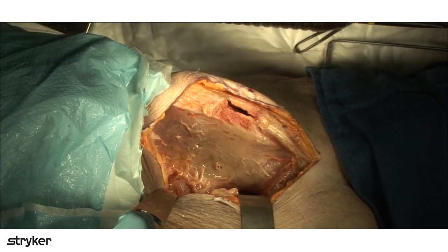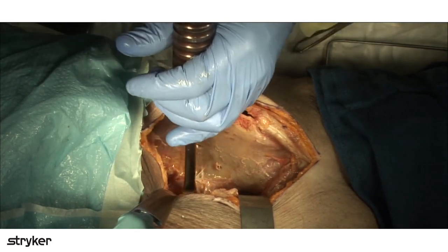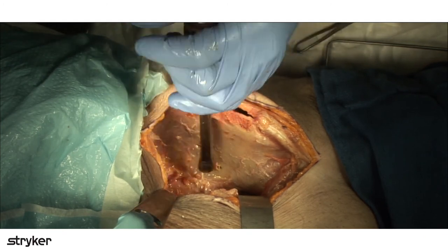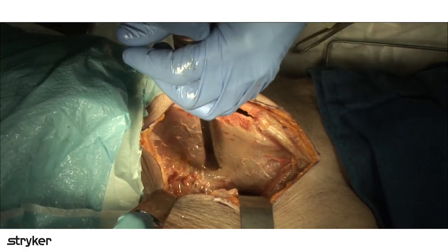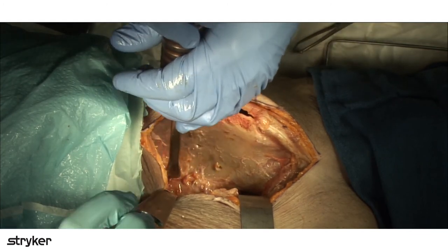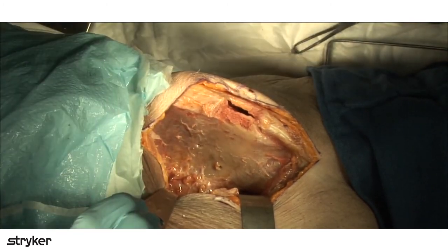I think another place where it might be useful is when you have those sacral ala fracture dislocations, where you have an anterior lateral fragment of sacral ala that's dislocated from the SI joint and flipped out. A lot of times that reduction through a standard lateral window is a little bit blind, which is nerve-wracking because of the L5 nerve root, but this would get you much better visualization to flip it back in and reduce it before you put in your fixation.